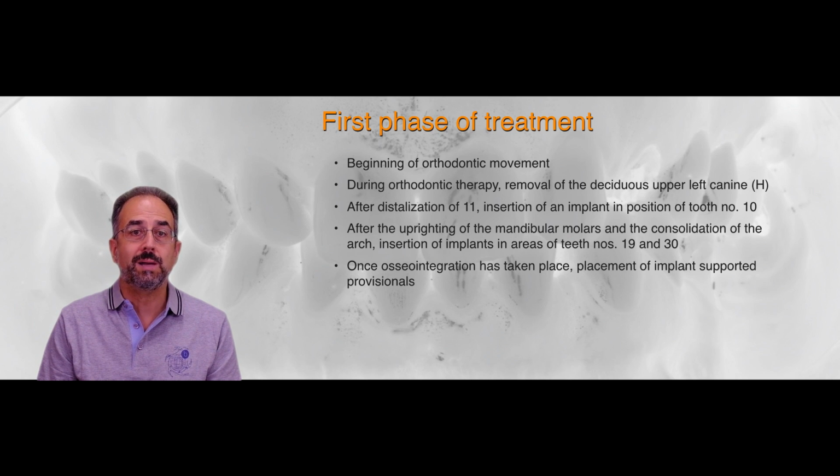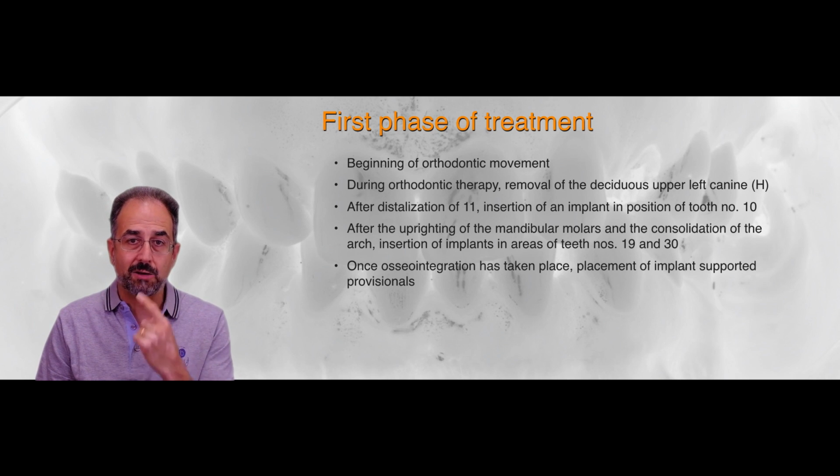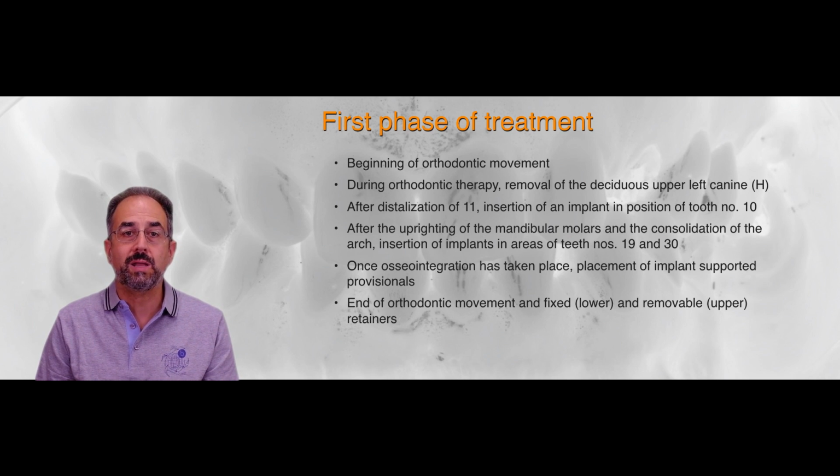And we placed the implants both in the lower molar area and in the lateral incisor. Once they were ready, we placed provisionals, screw retained provisionals, and finished the orthodontic therapy and put some retainers.